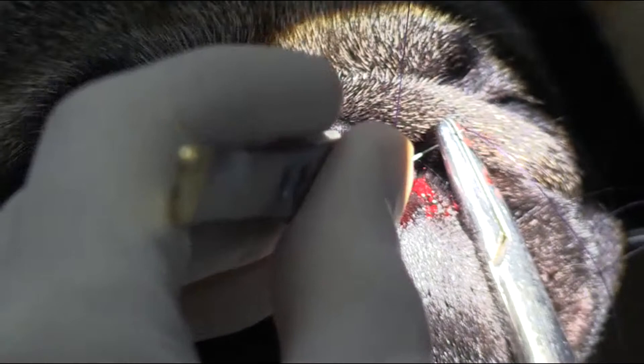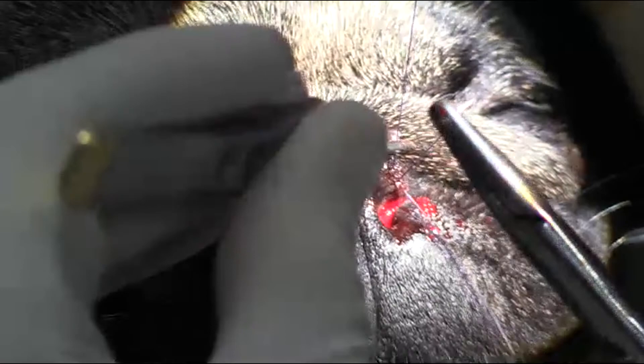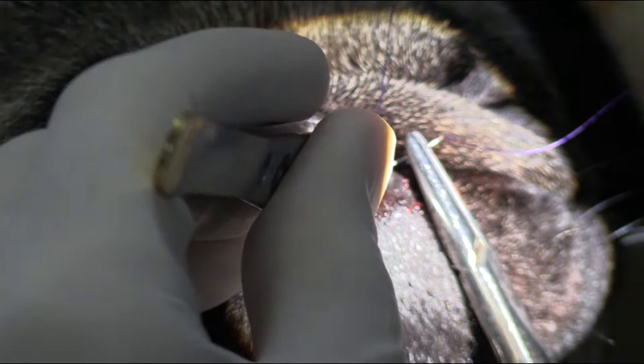There's a good question about whether there's a risk of aspirating blood during the procedure. As long as you've got the cuff inflated adequately then that shouldn't be an issue. Some people will pack the back of the throat with gauze sponges. If you're doing the folded flap palatoplasty and you're not using coblation then there is more potential for blood to go to the back of the throat, and in that case you'd be more advised to pack the throat.